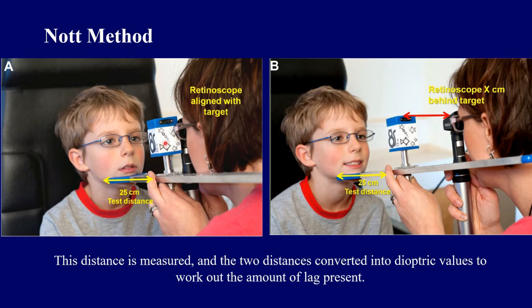So this is the idea. We start with the retinoscope and the target in the same position. Then, if needed, we will shift away, or we can stay in position but bring the target closer to the patient.